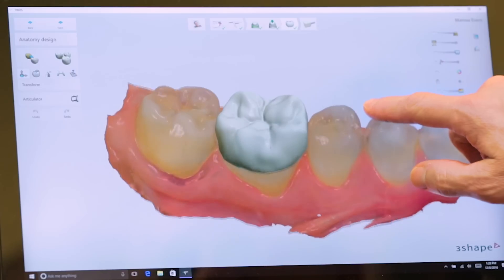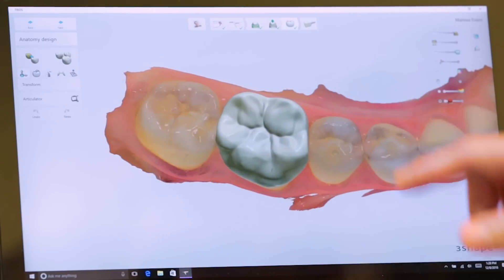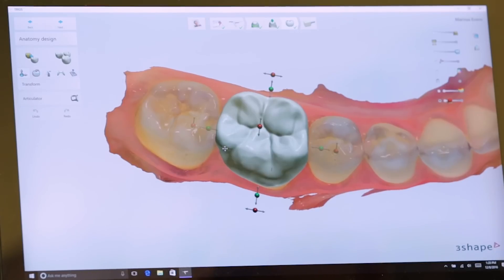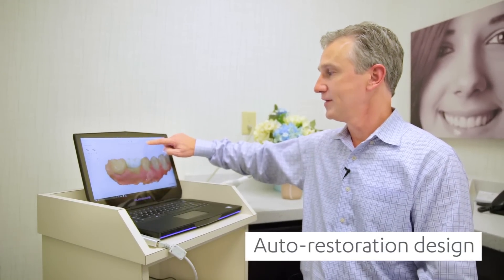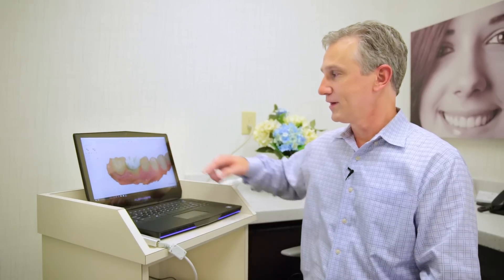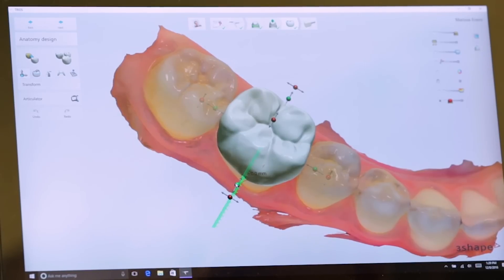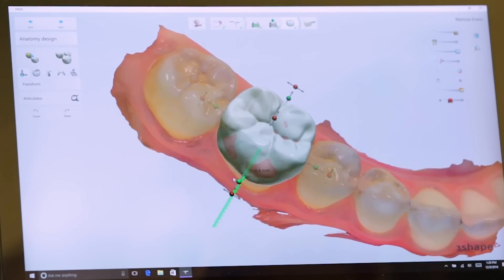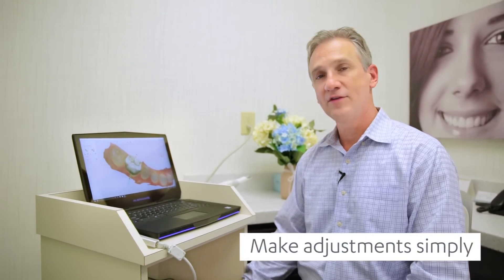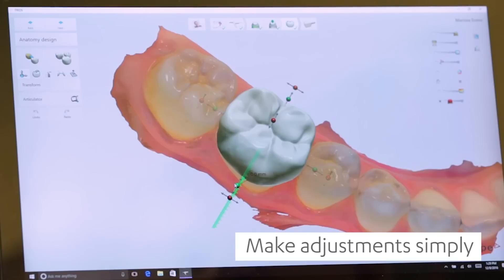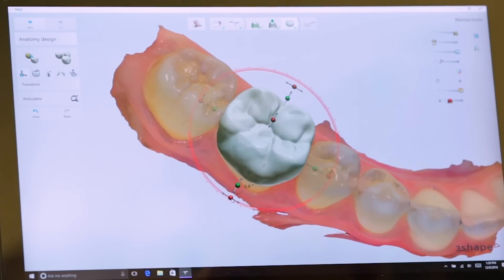As you can see, the software immediately gives you an idea on design. That can be changed if you'd like to alter, rotate, or change the shape of the restoration. Very quickly, most of the work is already done. The software allows you to make rotational changes, and you can see where the pink marks appear — that's where the restoration is going to be too thin. The original design was very, very close.